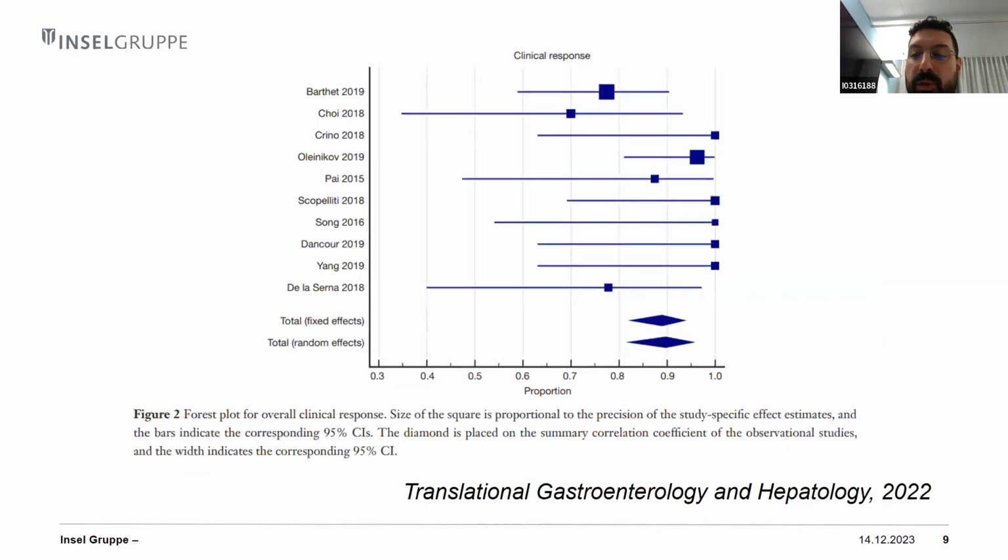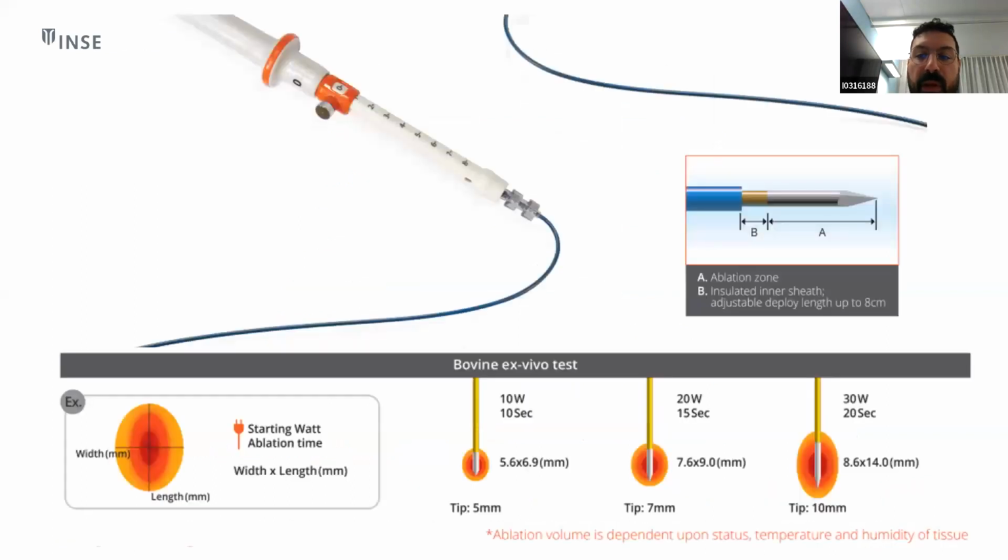However, its use with EUS in the context of a pancreatic lesion is a newer but demonstrably safe concept. RFA of a pancreatic lesion using EUS guidance offers real-time imaging guidance and visualization that lends itself to precision and minimal invasiveness.